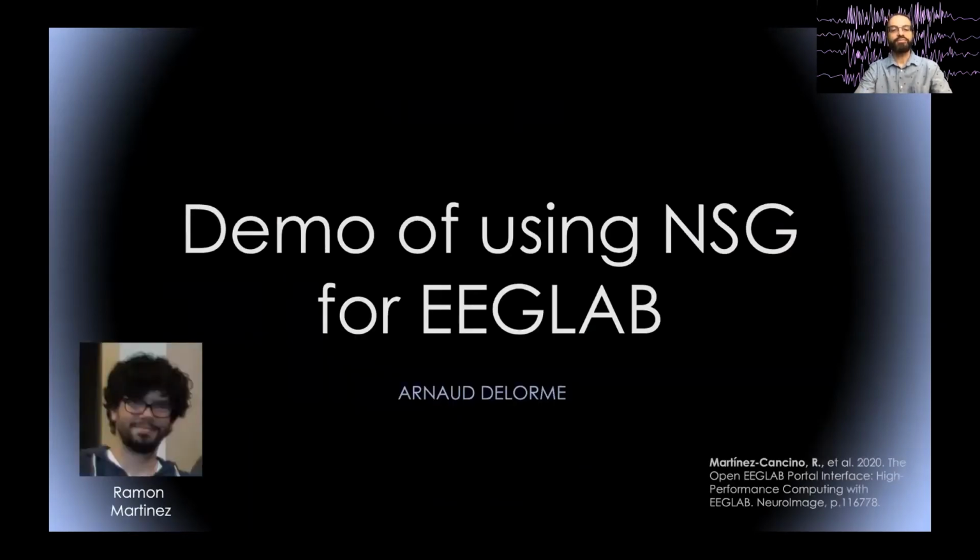So now let's move to the demo of using NSG for EEGLAB. I still have a couple of slides, so we're not going to do the demo right now. A lot of this work was done by Ramon, and he offered the paper in NeuroImage on how to use this plugin. You can look at that paper if you want more information. There's also a tutorial online on GitHub for using the plugin. A lot of the information I mention here is available in the tutorial.